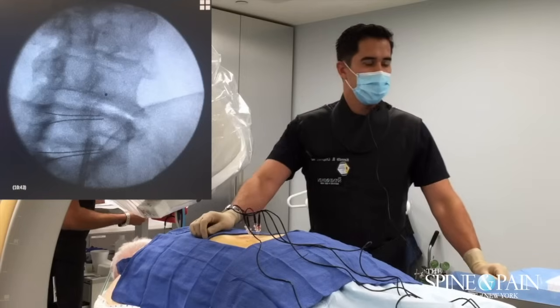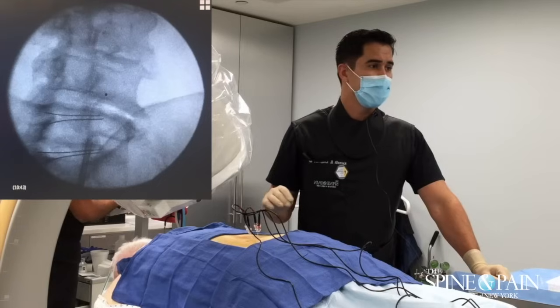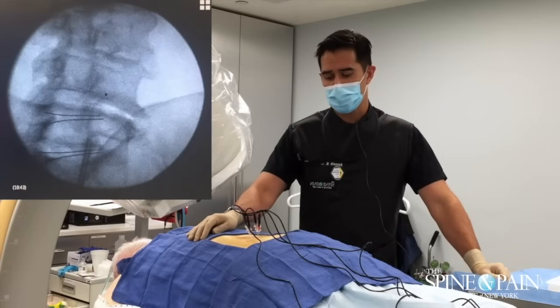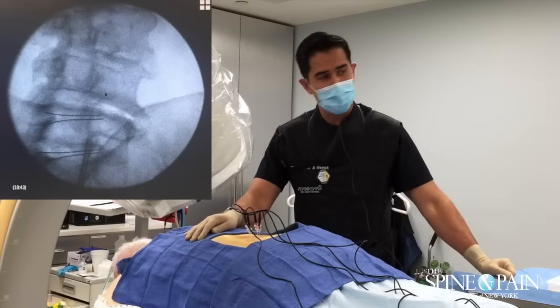Now we're going to test for motor stimulation. You can see we're not anterior to the bone. We don't expect to have a response if you're not on a nerve root — you're not on regular sensory nerves. That's good. You don't feel anything in the leg, right? Good.